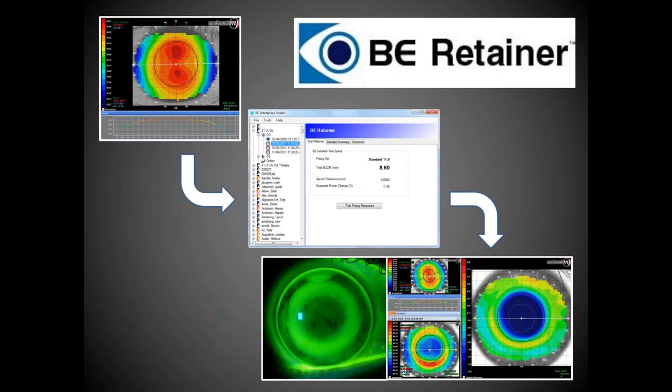An advantage of the BE system is that the practitioner doesn't need to be heavily involved in the whole orthokeratology process because the technicians can often do the baseline topography. The technician can be trained to look at whether the patient is a candidate in the software. The software tells you good from bad candidates. Then lastly, the software will tell you what actually happened. So topographically, did you have the bullseye, the central island, or the smiley face?